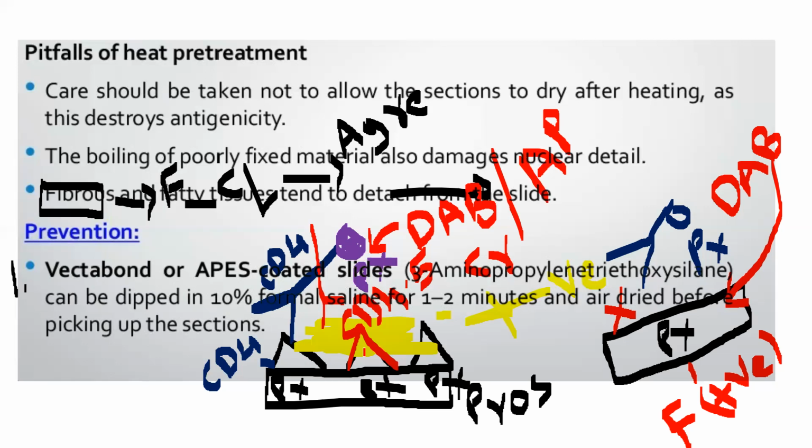So in order to prevent unwanted binding of antibodies to non-specific antigens, we need to block these non-specific antigens in the tissue. Only after these two procedures should we move forward to staining. That is why before staining, we must block the endogenous enzymes and block the non-specific antigens. How we will block endogenous enzymes and how we will block non-specific sites will be discussed in tomorrow's lecture.